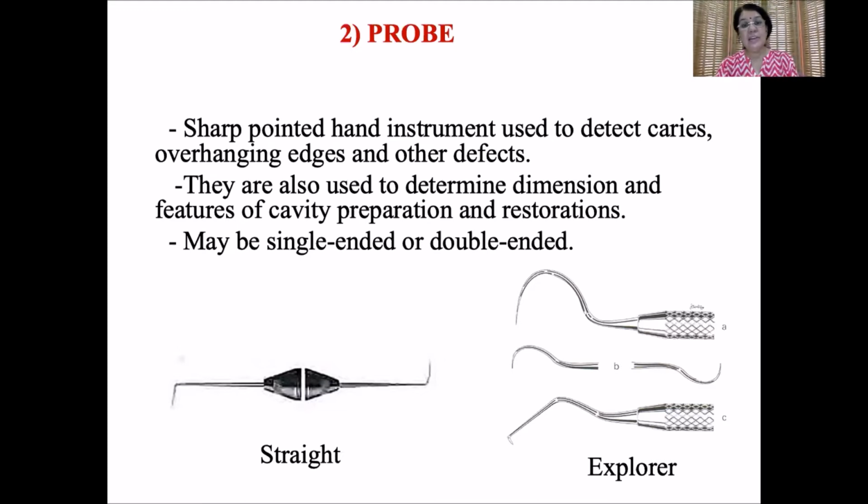So every dentist should have a very fine sense of tactile sensation, which will tell you between smoothness and roughness whenever an instrument is moved along any surface. Even in endodontic treatment, mostly you cannot see what is inside the canals. But if your tactile sensation is properly developed, you can make out whether you have reached the apex, or there is any obstruction, or there is any ledge formation.